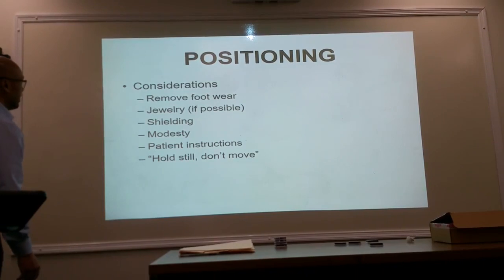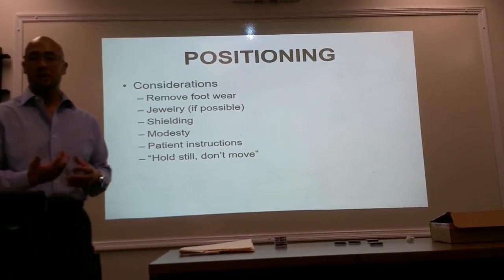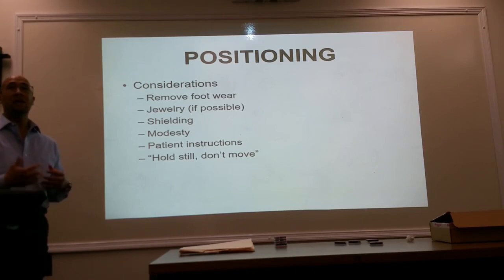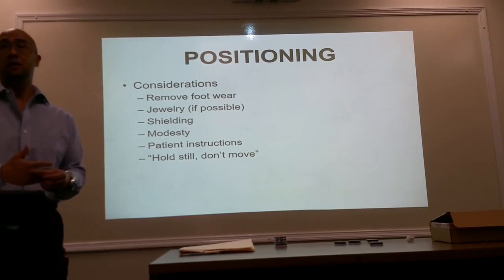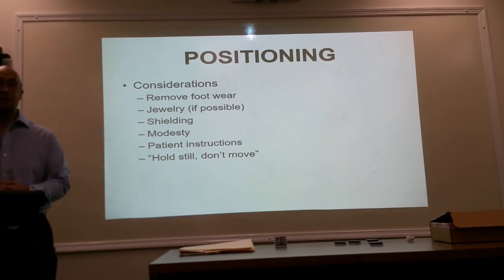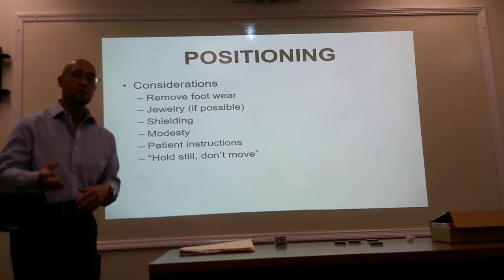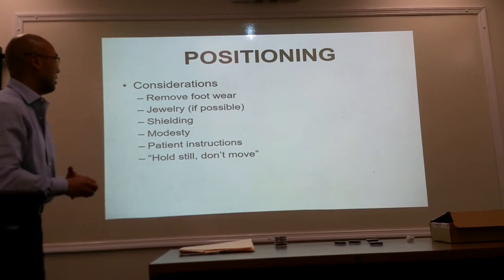Okay, positioning considerations: remove footwear. Our imaging systems now are very sensitive, and they can even pick up the fabric. So if you're wearing a sock, that can also be shown on the x-ray, and it may interfere with identifying hairline fractures. So remove shoes, remove socks, remove any type of body jewelry.